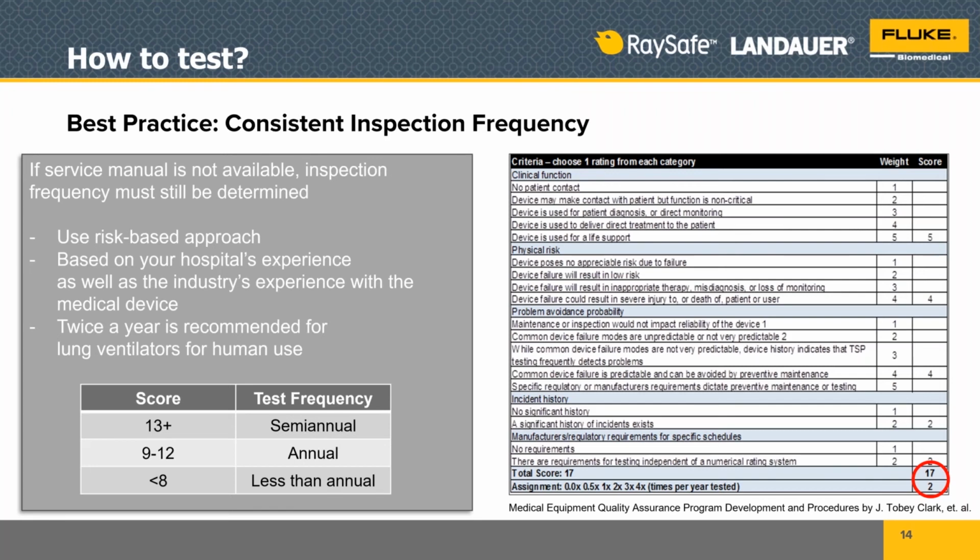I hope this opens your eyes to a different way to think about how often you should be testing, what your test frequency should be, because it does take into consideration not only the medical device, right, and how it's performing out in the market, but your own hospital experience with it. So like I said, if there are some components that fail more often than others, maybe you should check more often. But yeah, this is a really good overarching view of how test frequency could be determined rather than just following what the OEM service manual says.